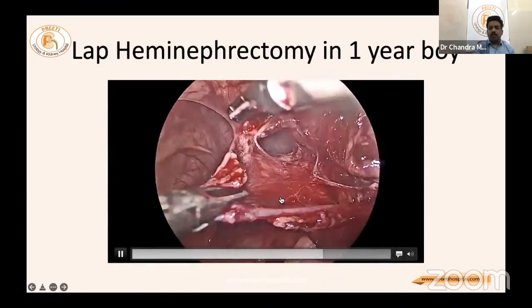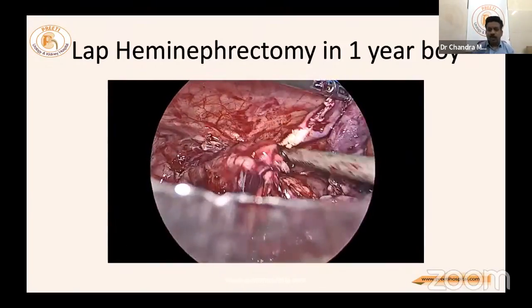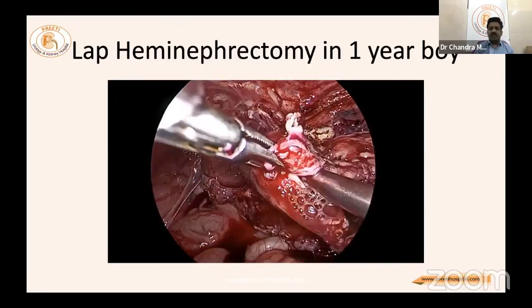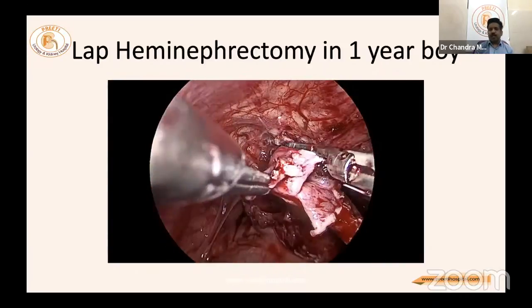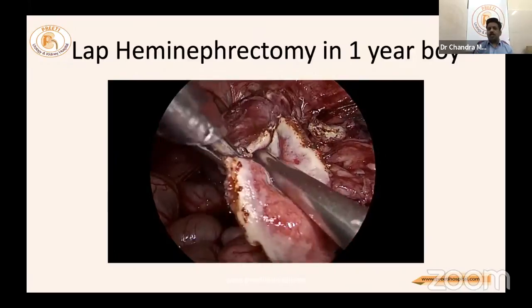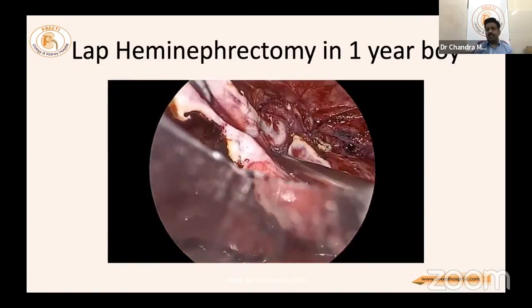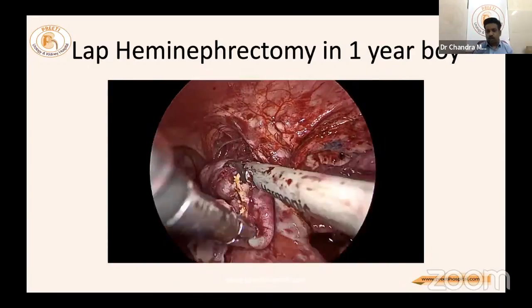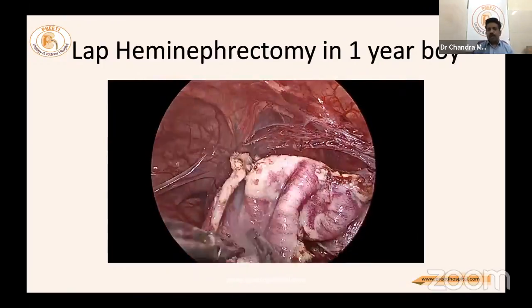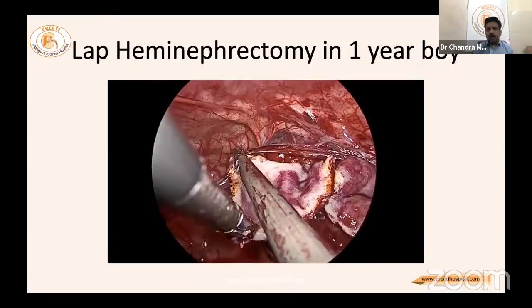After division, the normal ureter is identified — very close to the dilated system. The anterior aspect of the dilated ureter is laid open and all pus is sucked out. The ureteric catheter makes the normal ureter prominent but may also cause injury. The reason for laying it open is to avoid closed stump syndrome. This lay-open approach — and never resecting the ureter stump — ensures open drainage.